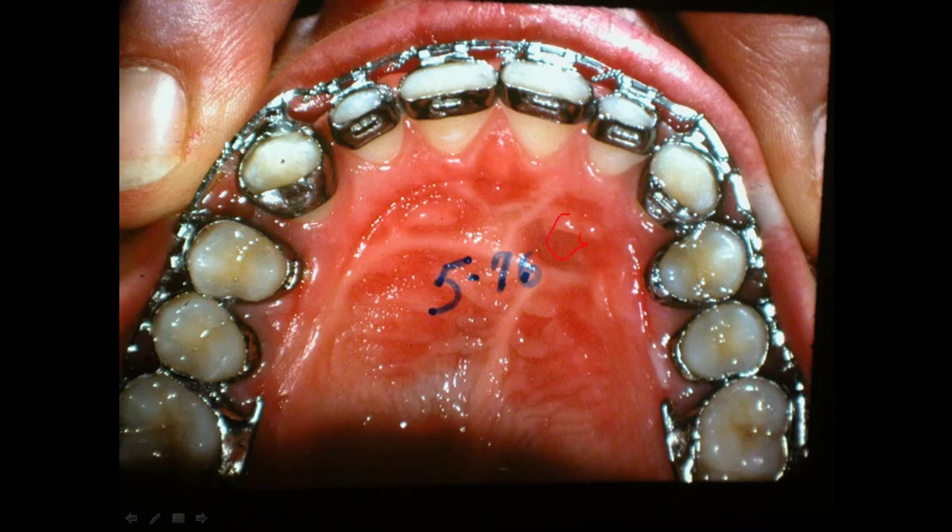If I had known, I might have been afraid to separate it this much. When I separated it, this little defect was the same size when I started as it was when I finished. It never did fill up, of course.